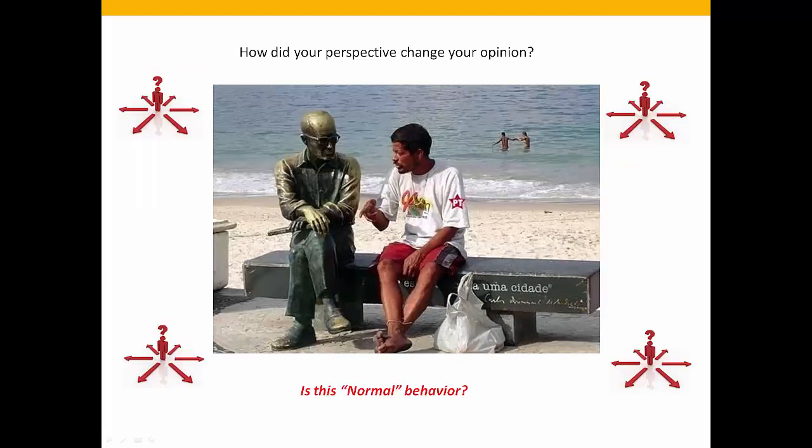Just like this photograph, two-dimensional radiographs just offer a view of one plane of space. It does not give you the ability to walk around the subject and see it in all three planes of space. Cone beam CT allows you to not only view the object in all three planes of space, but you can slice through the object, eliminating all the superimposed structures so you can get a clearer view of what you want to look at.